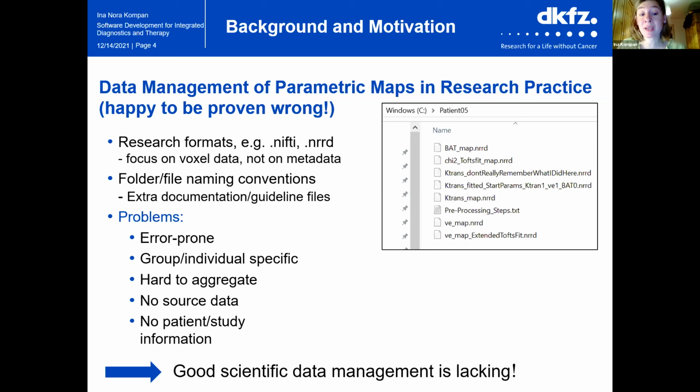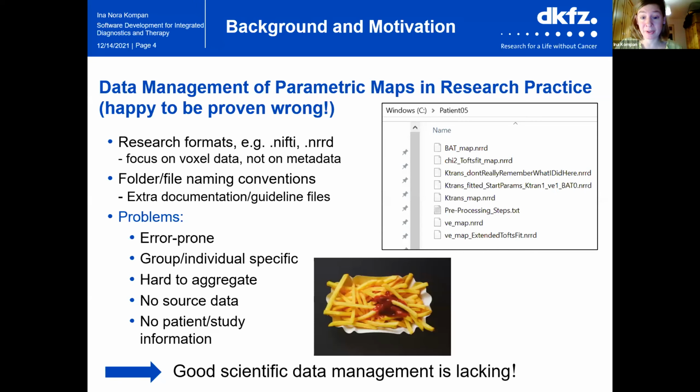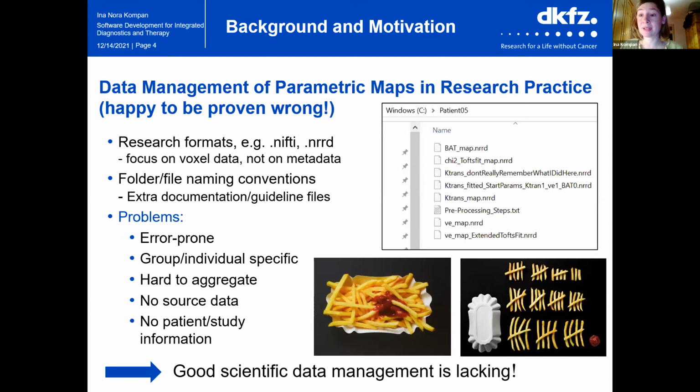So in summary, I would say good scientific data management is currently lacking in the perfusion MRI community. Instead, a bit of a mess is going on, and it would be nice to clean things up, just make data management more structured and organized.